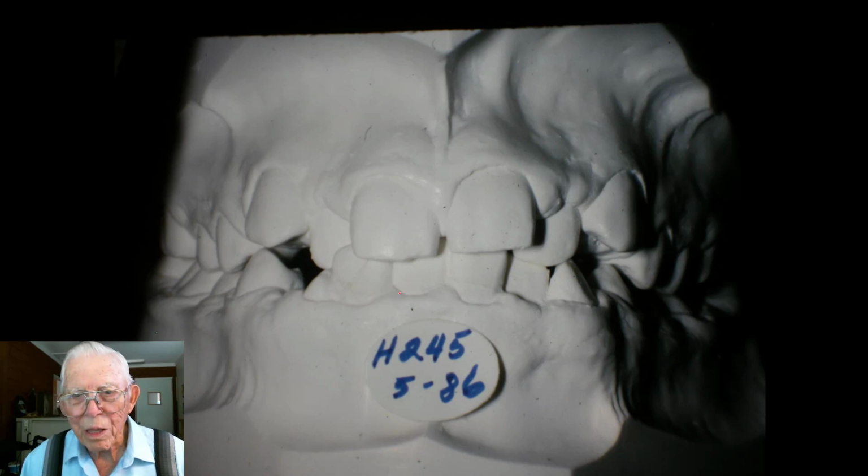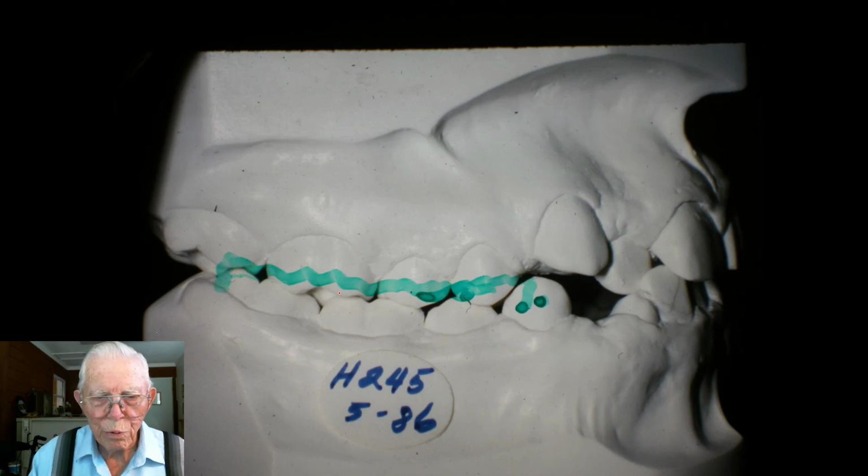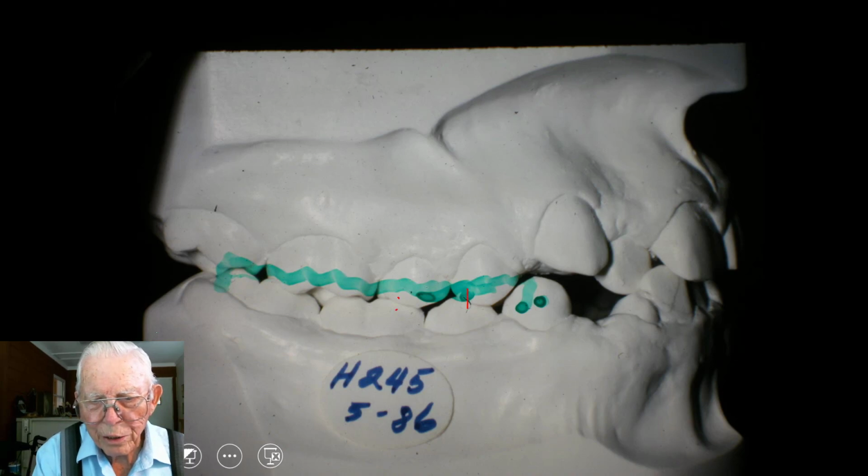Okay. Now, if I come in here and look on one side of the mouth, here's where we put these blocks. And you see the lower teeth are getting widened out to where you're contacting with the cusp on the teeth. So we put this little thin layer of acrylic on here, and that makes the jaw easy to go back and forth.